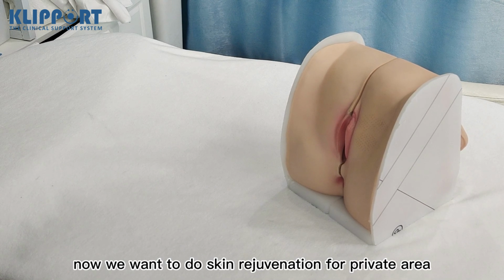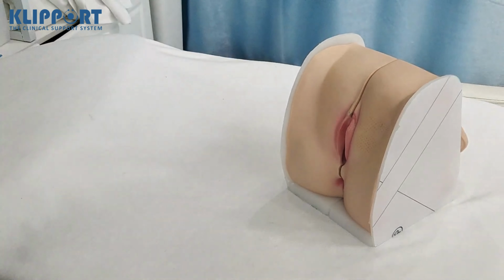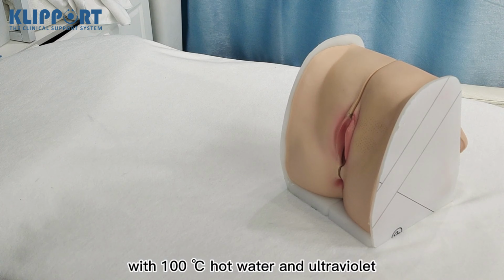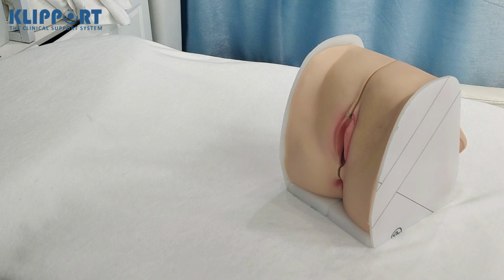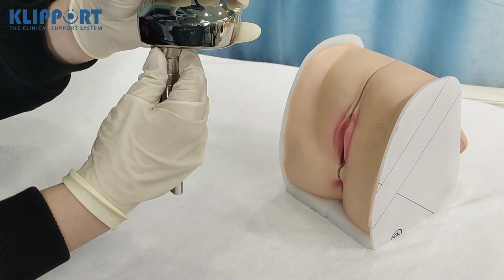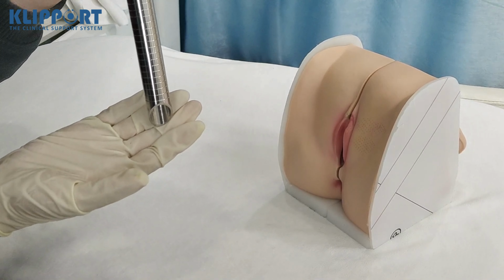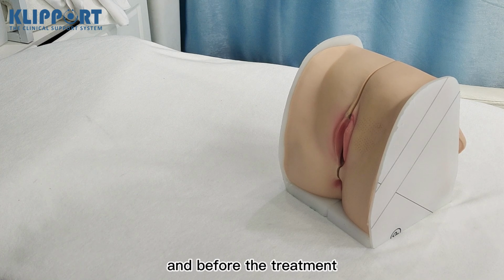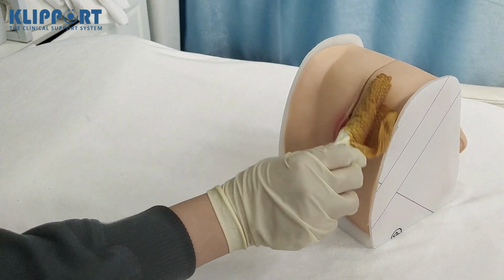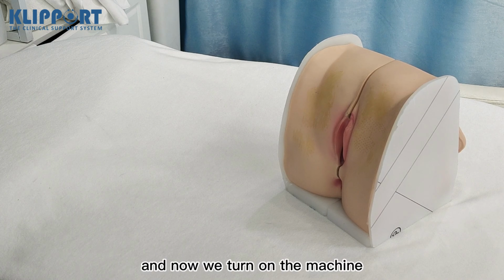Now we want to do skin rejuvenation for the private area. We use this handle. And before the treatment, we have to sterilize the handle with 100-degree hot water and ultraviolet. Now we install the handle. And before the treatment, we sterilize the treatment area. And now we turn on the machine.